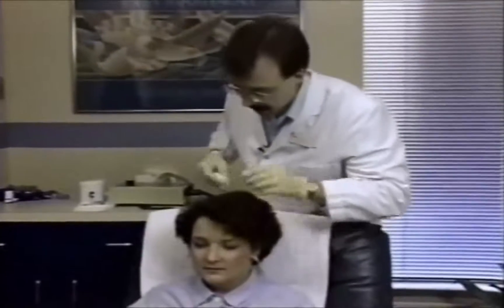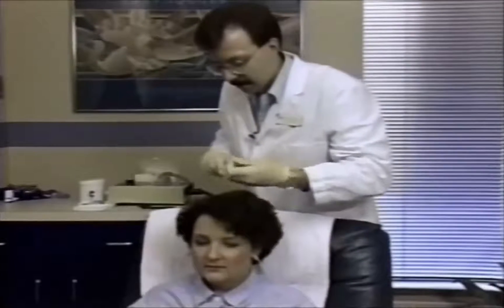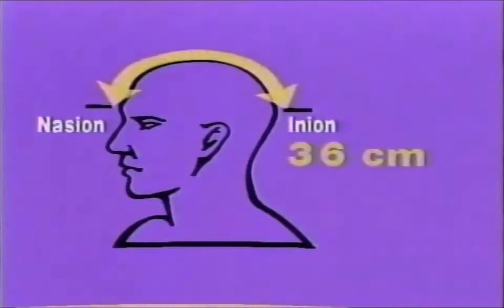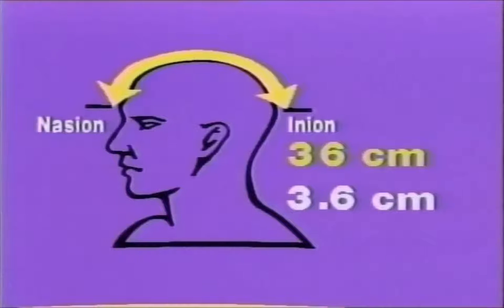The next step is to take a special measurement from the front part of the head to the back to assure proper placement of the frontal electrodes. To measure for the FP line, measure the distance from the nasion to the inion. This metric measurement is noted by the technologist, and the decimal point is moved one place to the left.